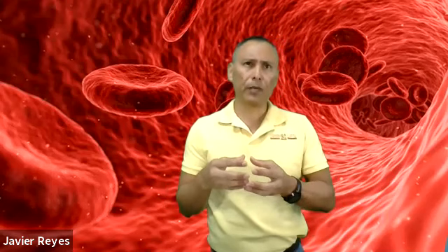Some of those blood electrolytes that are there in the serum and the plasma are going to be elevated. So think about the example I gave about a glass of water. A glass of water, completely full, and you put in 10 teaspoons of sugar. Then you decide, you know what, I'm just going to take out some water. So you take out water, and now that glass is going to be more concentrated with sugar. It's going to be a lot sweeter. So any changes or decrease in fluid is going to alter the results of the specimen.